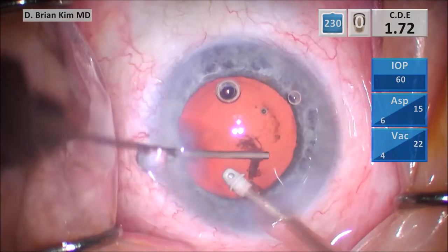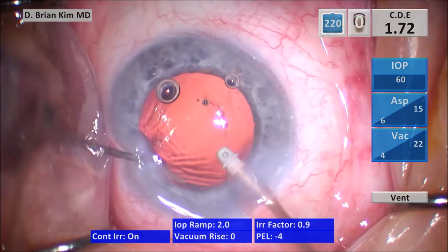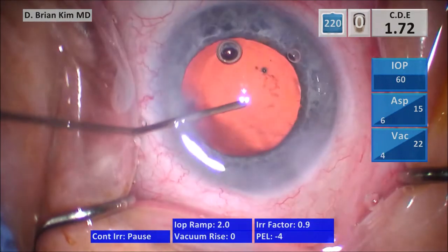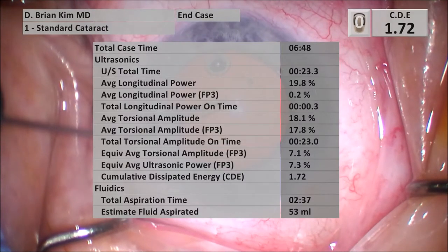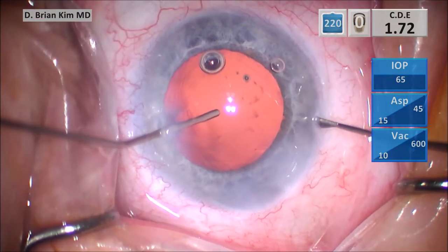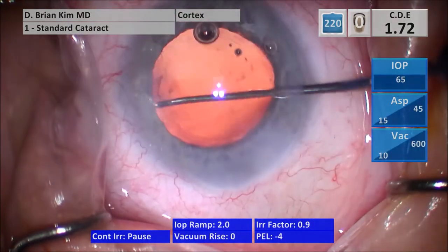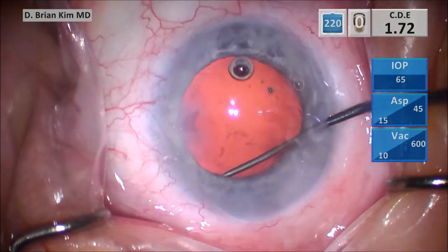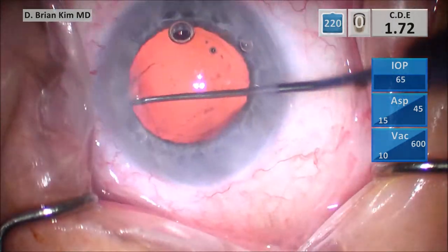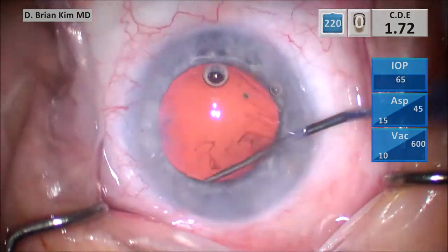I'm using the BSS cannula to pulse the subincisional capsule fornix, and you can see quite a bit of lens material comes out. I notice this more when there's quite a bit of cortical and lens material stuck to the bag, and there are a lot of posterior capsule adhesions with more subincisional lens material. I fill the capsular bag with cohesive viscoelastic, then sweep first on the left side and then the right side underneath the rhexis edge — there's quite a bit of lens material that's coming out, but I'm very carefully and patiently teasing all that out. It's always important to check and to sweep.